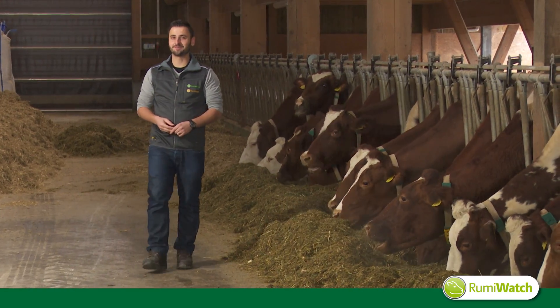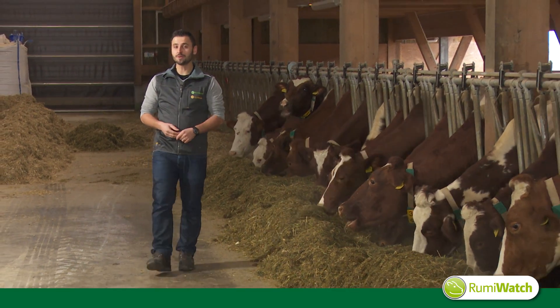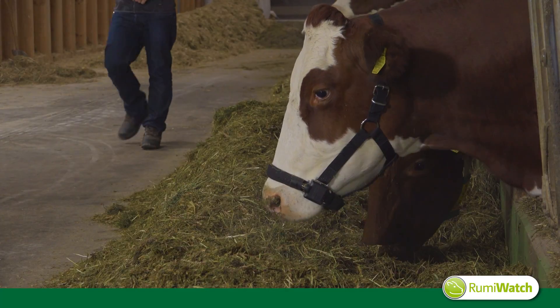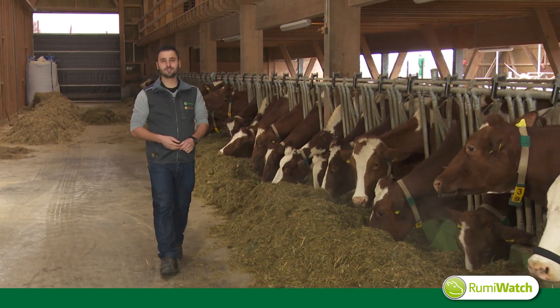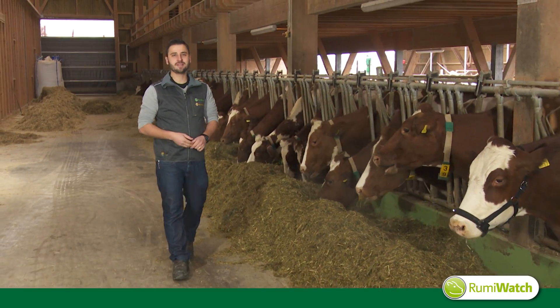Welcome, my name is Christian. I'd like to present you the RumiWatch system, an animal monitoring system for scientists. Today we will see the application of RumiWatch for intake estimation and posture.